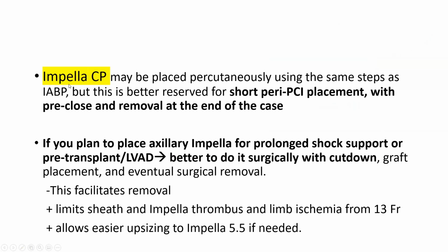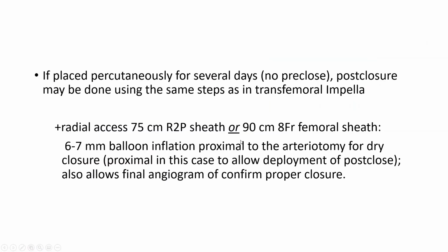Now, let's say you have placed Impella CP percutaneously and you have left it in for several days, so you don't have a pre-close, which, like I said, shouldn't be the usual scenario. But let's say you've done it in a prolonged shock or pre-permanent LVAD. How do you remove it?